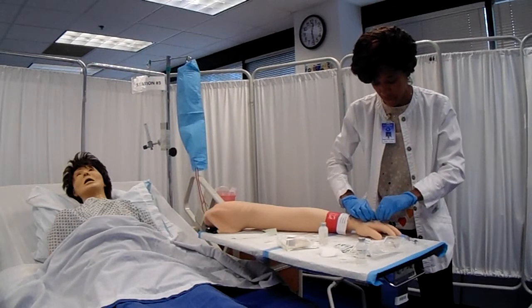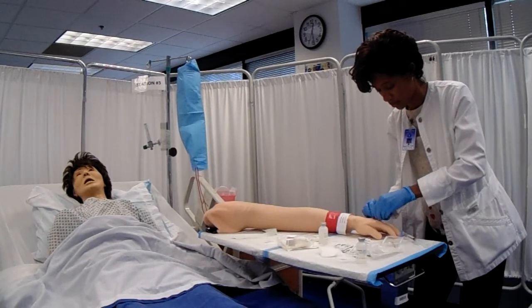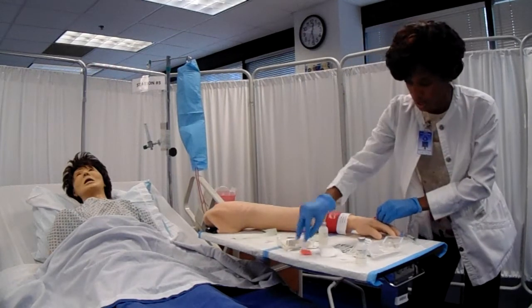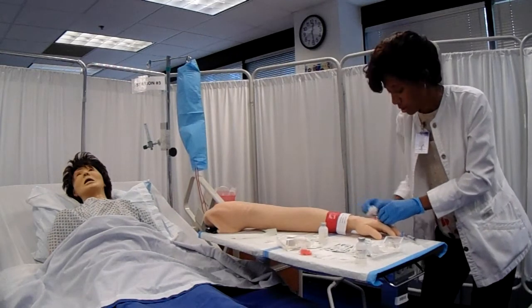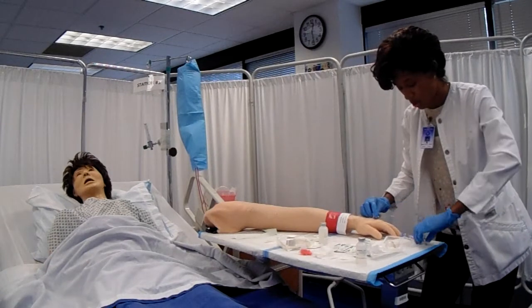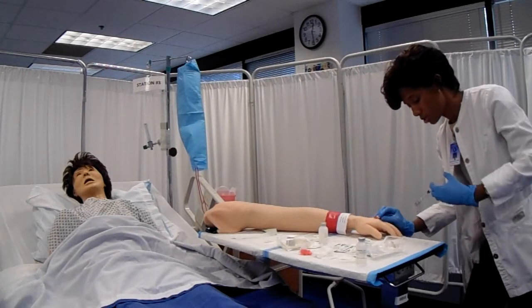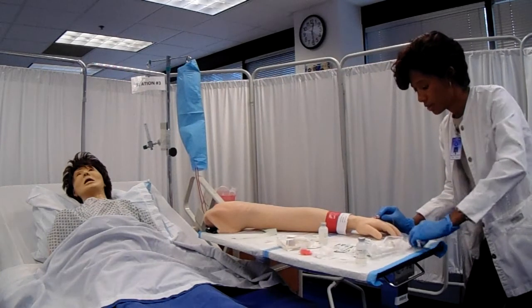A little blood at the site is okay. Fortunately, I have extra gauze. Miss Cyrus, are you still comfortable? Yes? Great. Okay, at this point, before securing, I'm going to flush to check for any signs of infiltration. There are none.